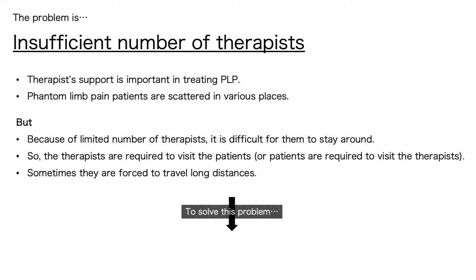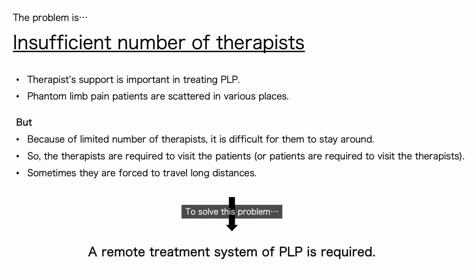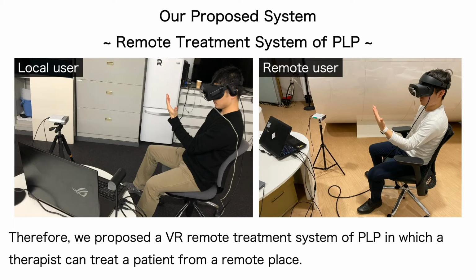To solve this problem, it is necessary to realize a remote treatment system that enables therapists to provide treatment to patients from remote locations. Therefore, we proposed a VR remote treatment system of PLP in which a therapist can treat a patient from a remote place.